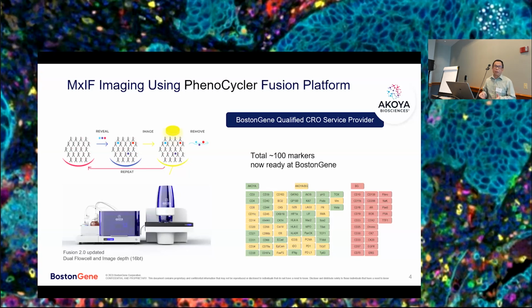So this technology, the center, is to use DNA barcode conjugated antibodies, as I listed here. All these are Akoya provided antibody ready-to-use conjugates.